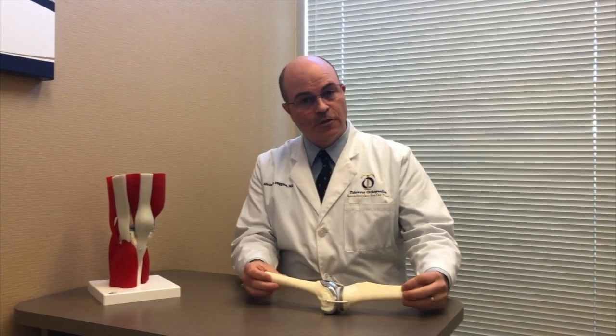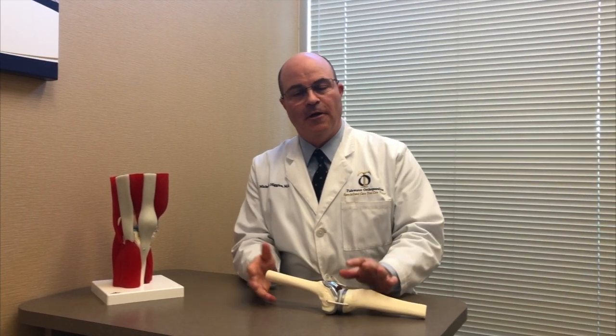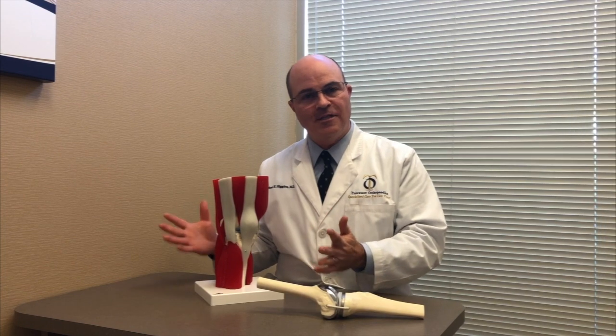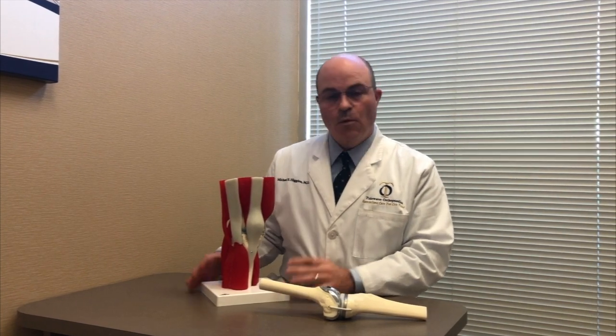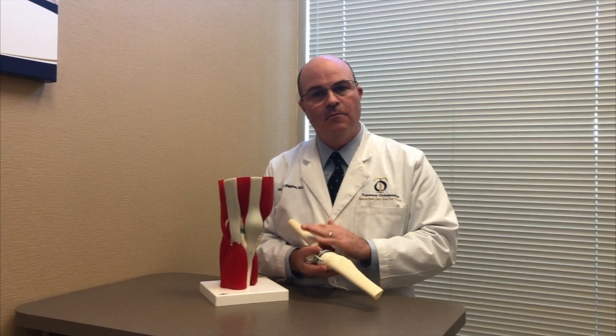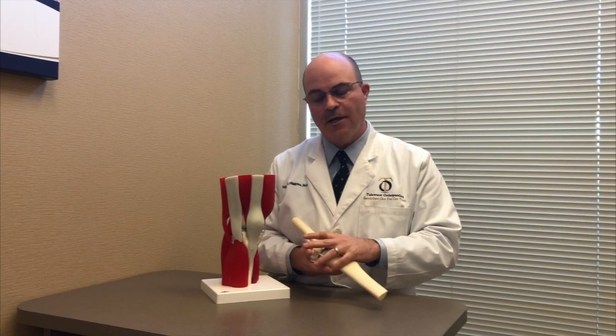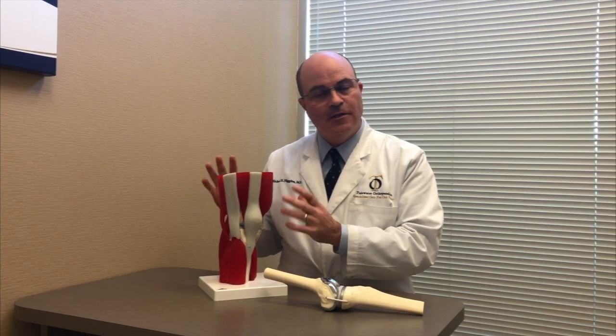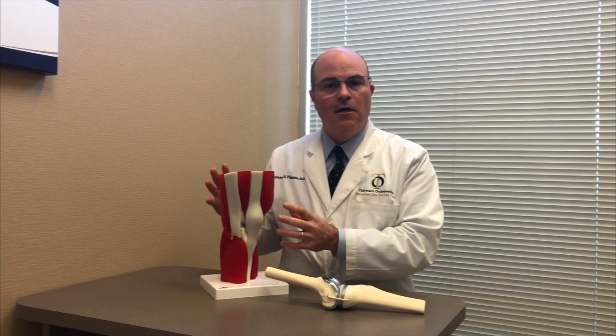The way I do the surgery is a muscle sparing approach. That's my approach to all my joint replacements, hip and knee. What I mean for a knee when I say muscle sparing is that when I do the surgery, in order to get these implants into the knee and rebuild that arthritic knee, I don't cut any muscles and I don't cut the quad tendon around the knee.